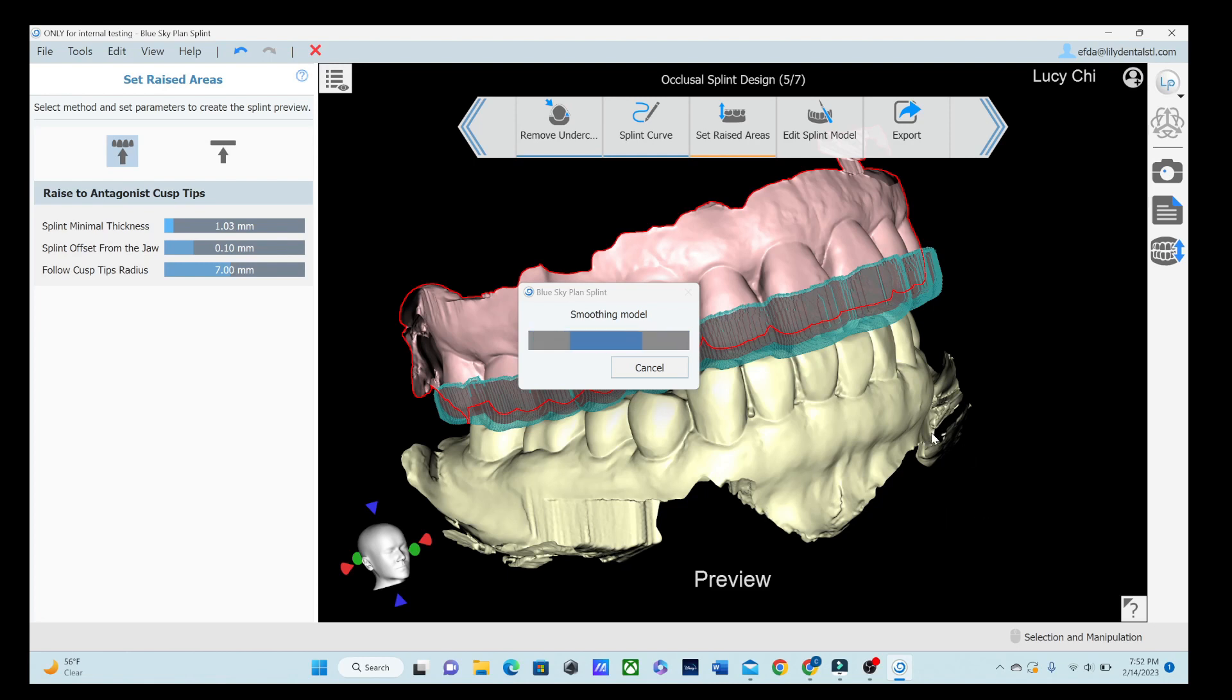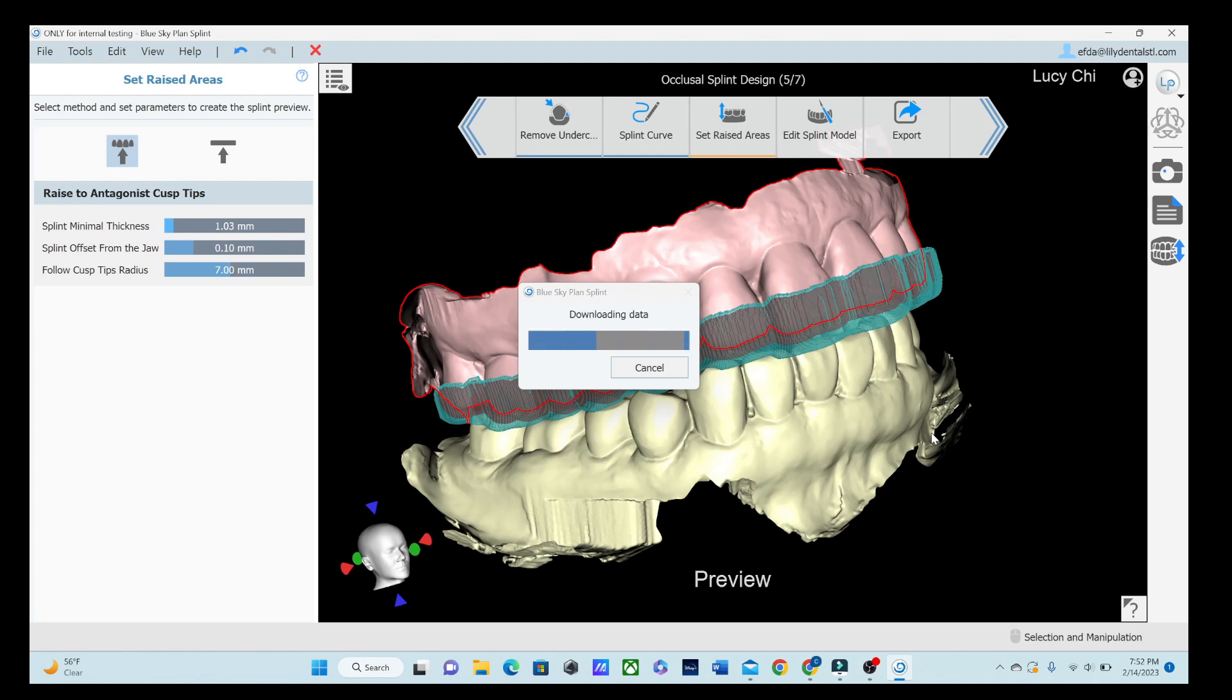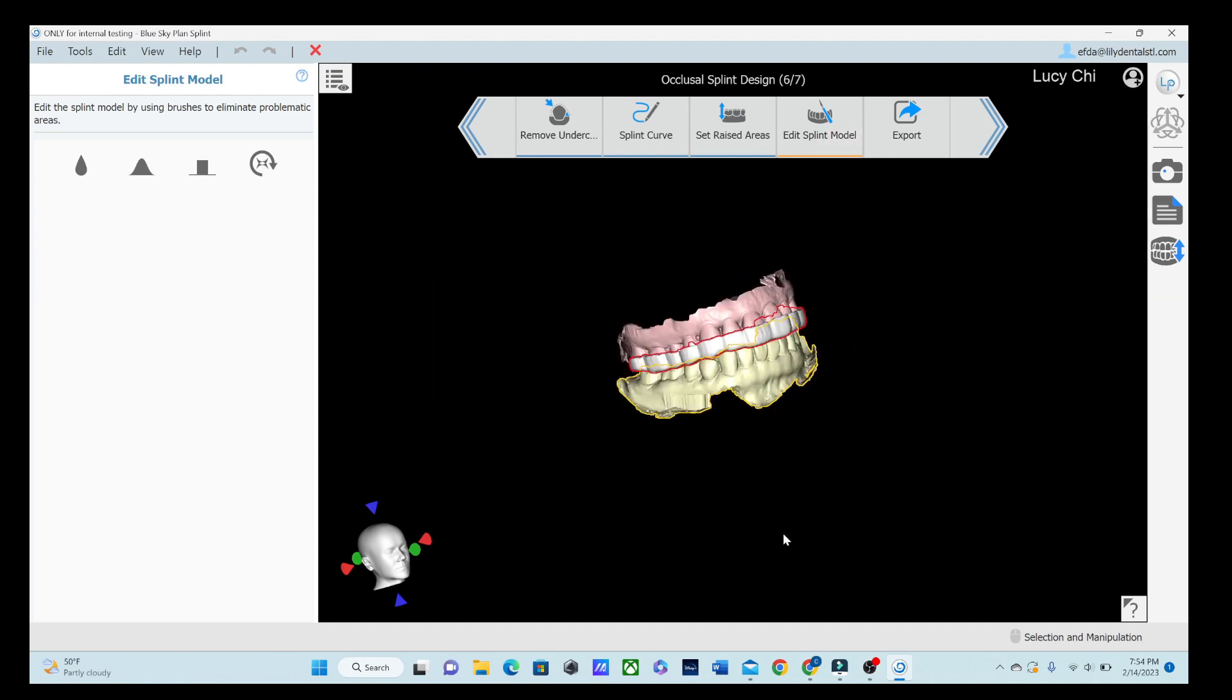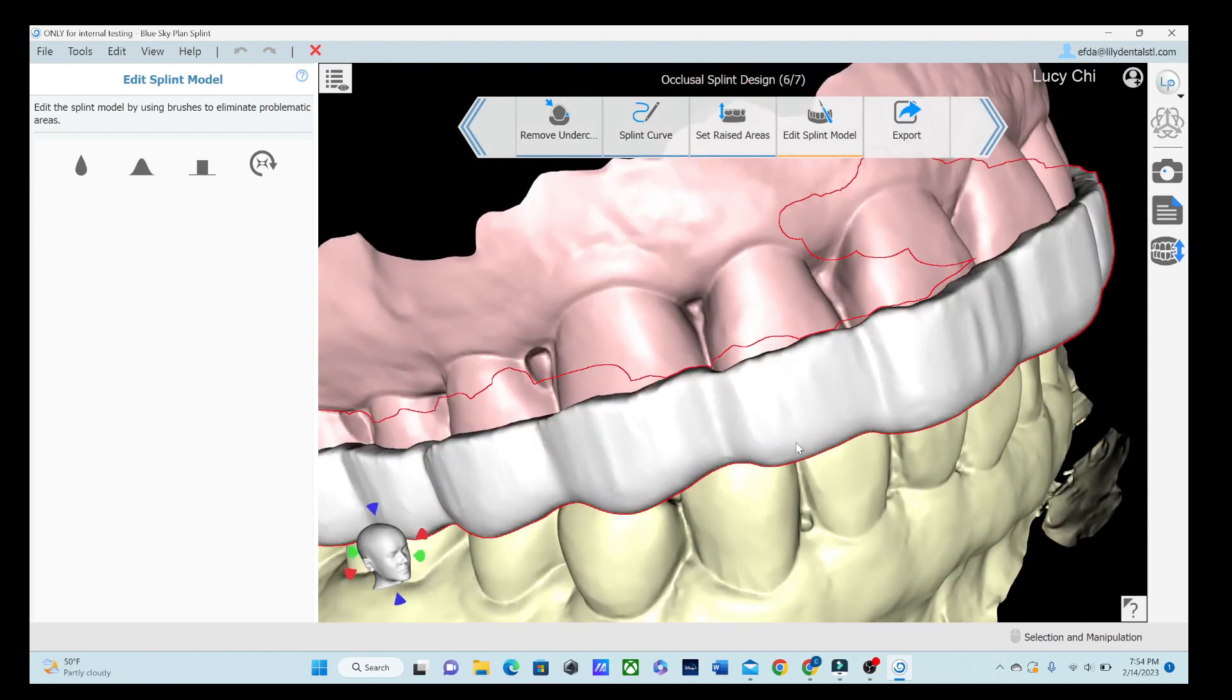The nice thing is these things will print pretty fast. If you have the Sprint Ray Pro S you can use the Bolt Speed and then if you have the Pro Cure 2 it even cures it a lot faster. We have the Pro Cure 1 so it does take I want to say like 44 minutes. Hopefully be upgrading soon. And we've got our Splint.